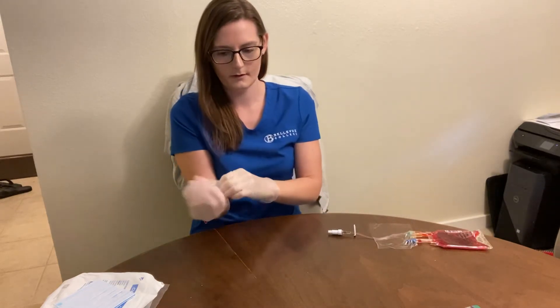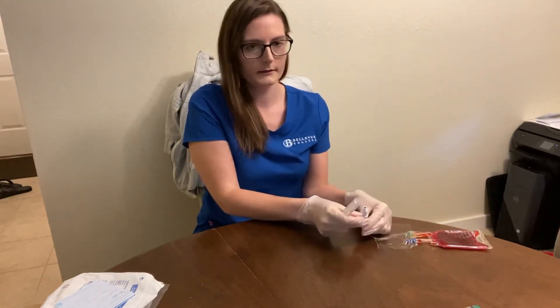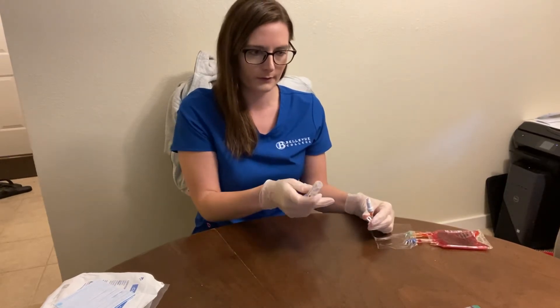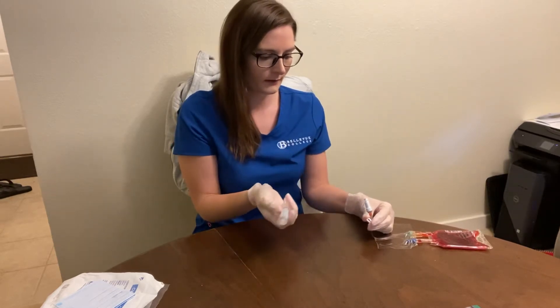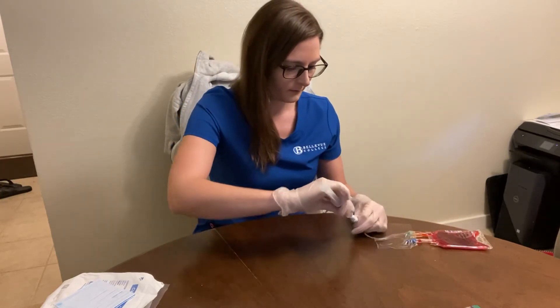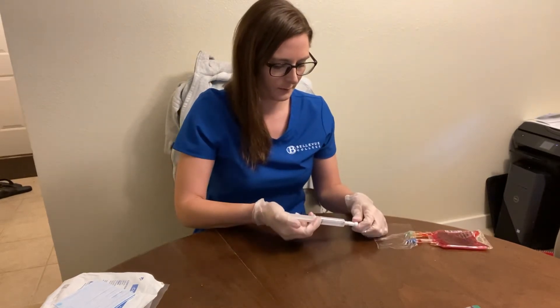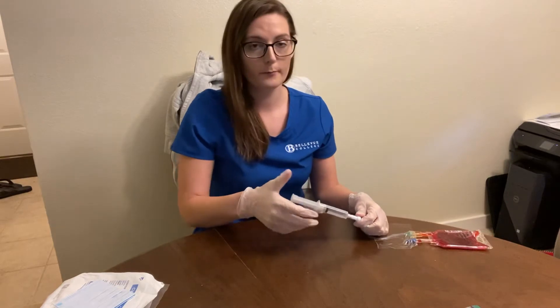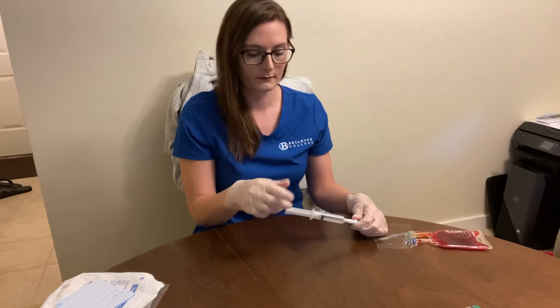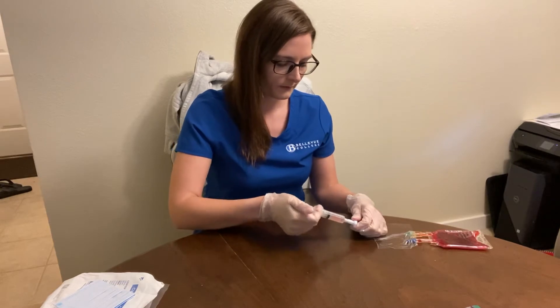First, I'm going to get my saline flush. I'm going to take the cap off, unclamp, and every time I use a syringe, when I take it off, I'll clamp and unclamp to do anything else — I'm just not going to say it every time, but I'm going to do it every time. I'll put the saline on, put about half a ml in — I would have primed this one and all the other ones. Then I'm going to get a flashback of blood and pulse this through.